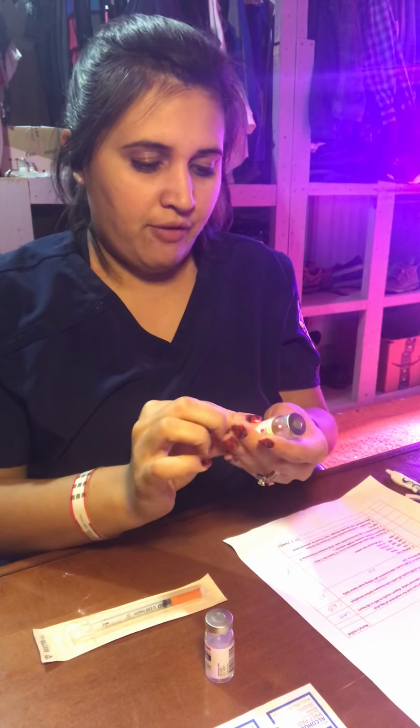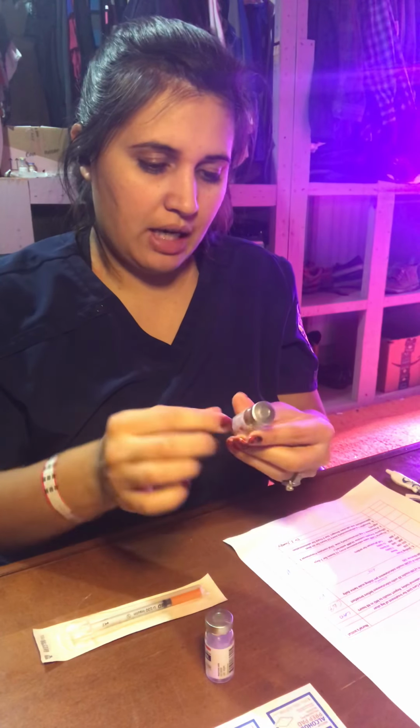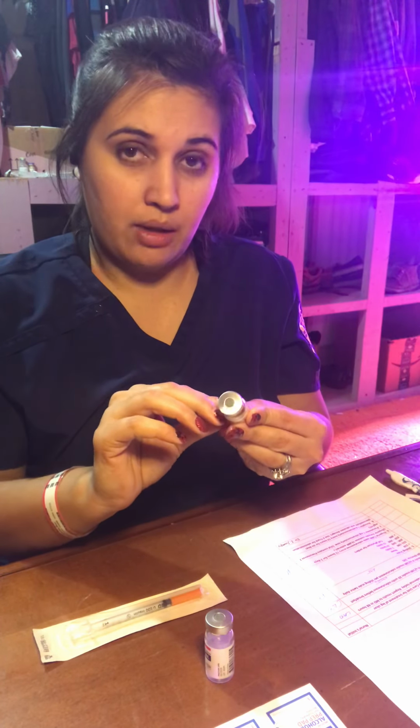I'm going to check the vial for any cracks. I'm going to check for the expiration date. I'm going to check if it is a multi-use vial. I'm going to check the date and time that it was opened, because it's good for 30 days after.